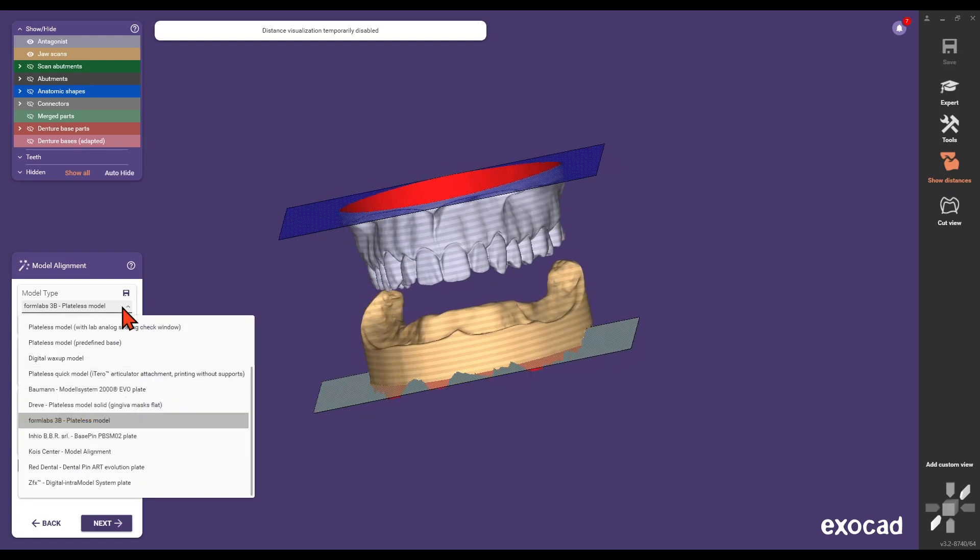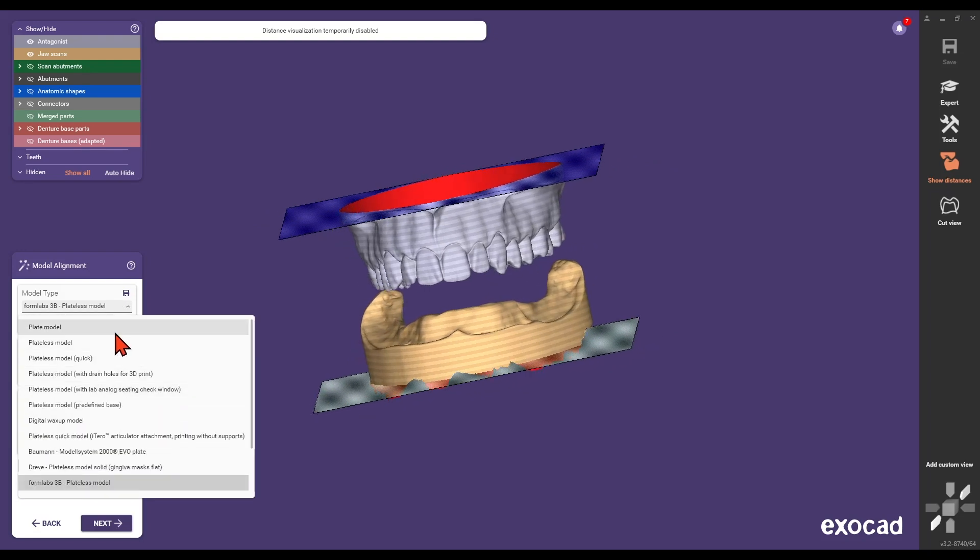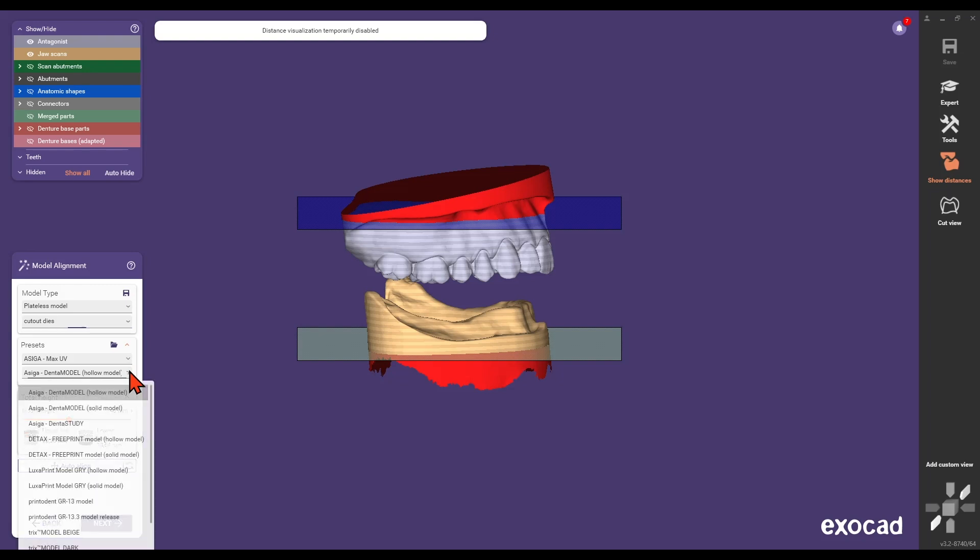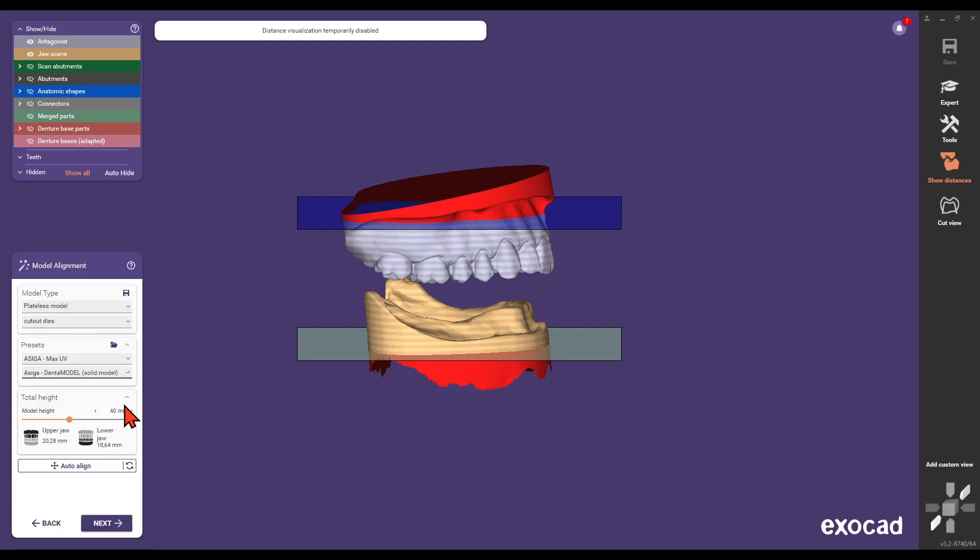Select the model type: plateless model, cutout dies, or a similar type. Ensure you choose a basal closed, solid model. Do not use a hollow model.